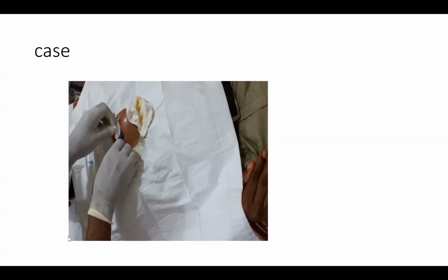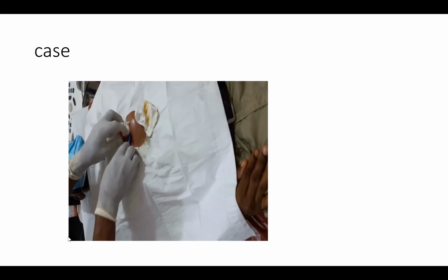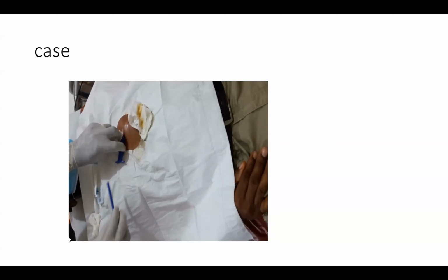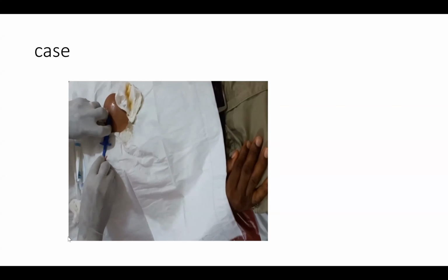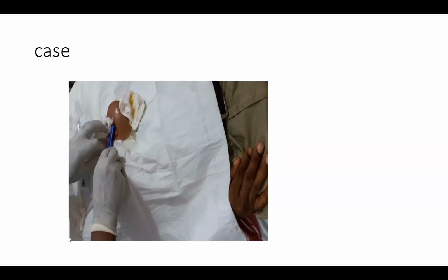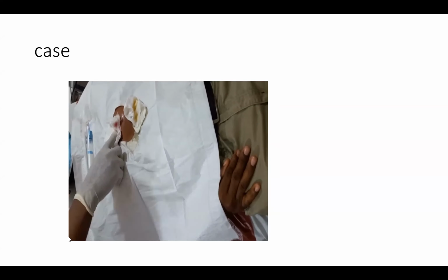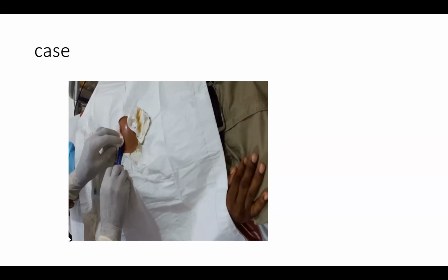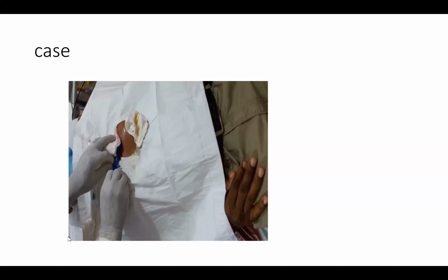Then the other issue is that, as you said, the key thing when you do this implant is you have to ensure that the skin is adequately prepared, because the commonest problem with this implant is infection. And once it gets infected, you just have to take out that implant. Since I've been doing them, I've not gotten any infection because I take very aggressive measures to prepare the skin to ensure that you don't have any infection.